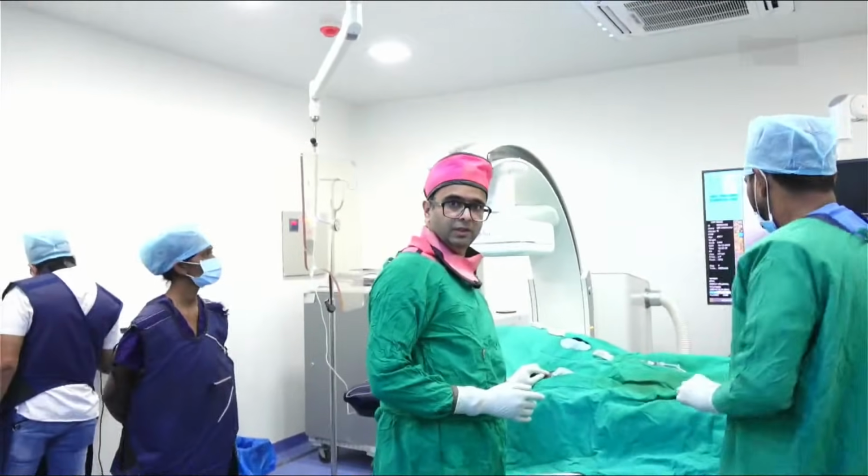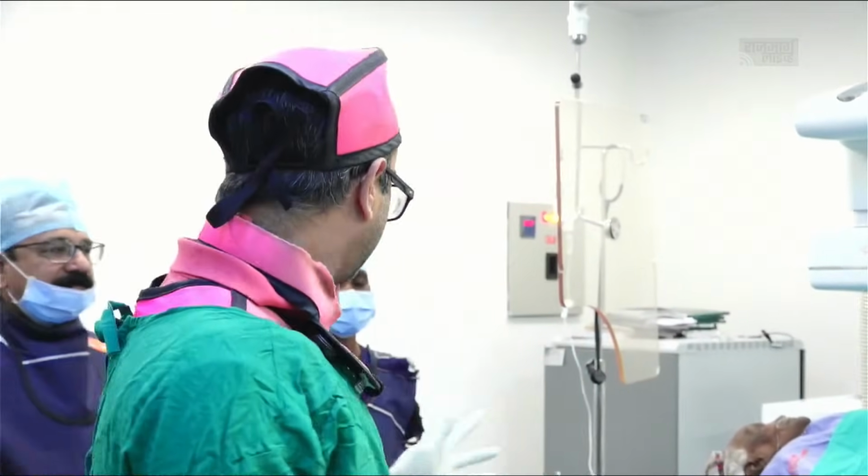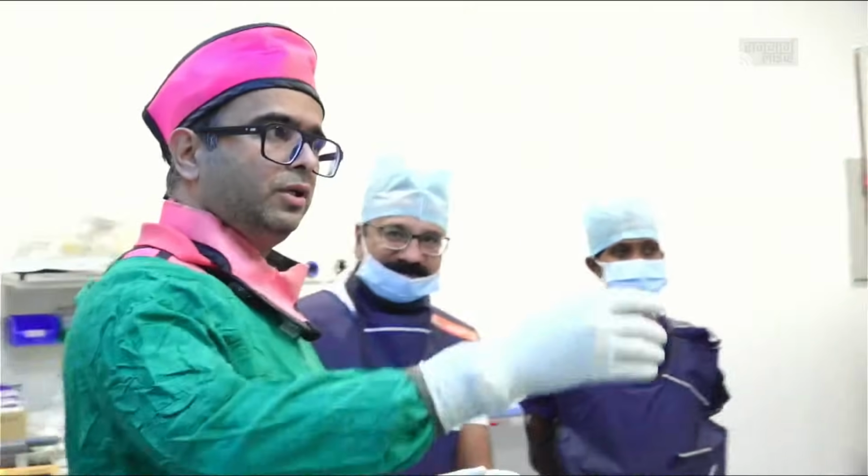Good evening, everyone. Today we are going to do angiography. This is our cath lab. This is our staff, Dr. Joshi, Dr. Hingne, and myself, Dr. Amol Kothalkar.